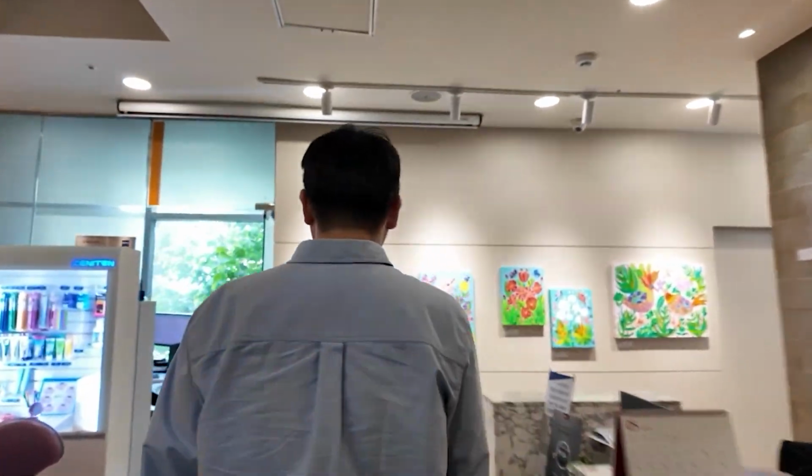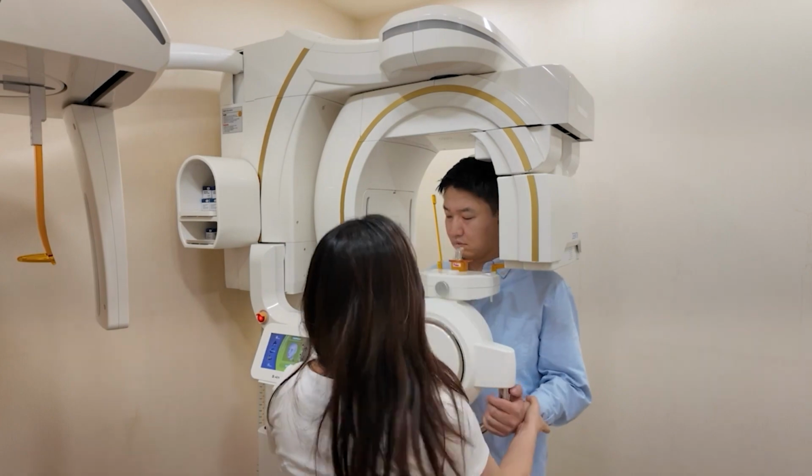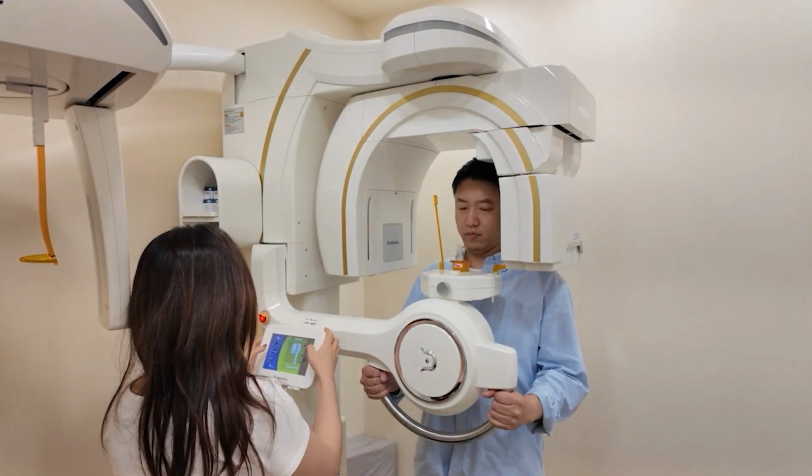Today, I'm thrilled to show you a step-by-step guide of getting a ceramic inlay, all in just one visit.